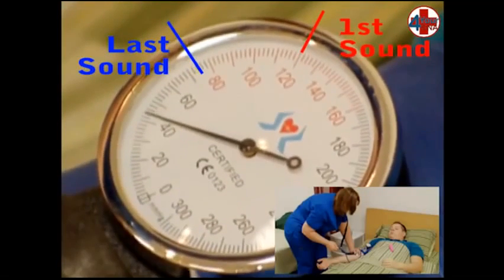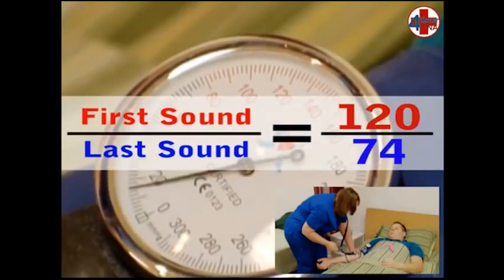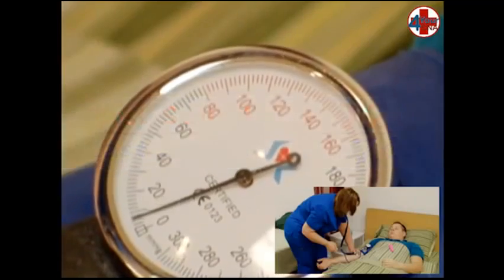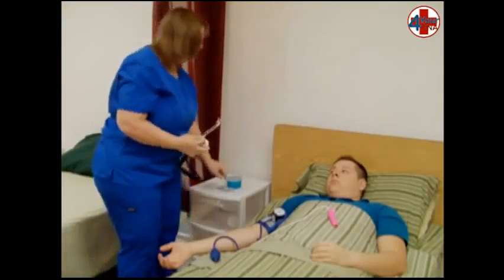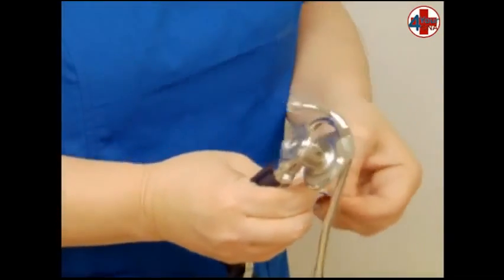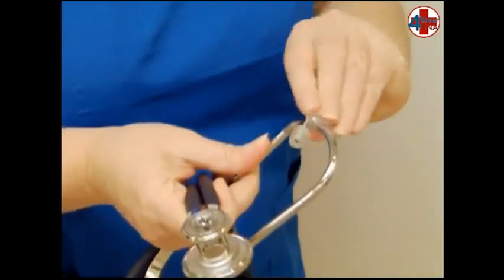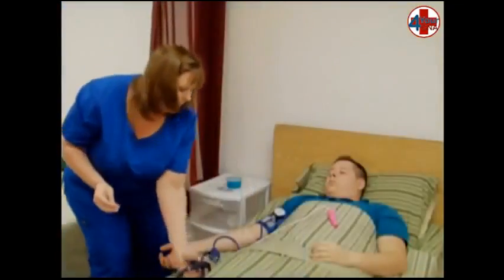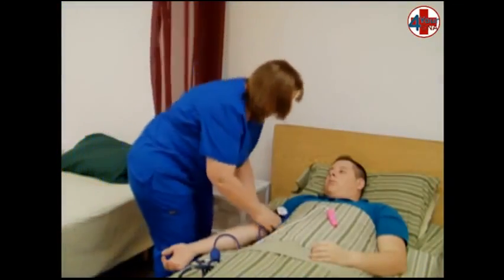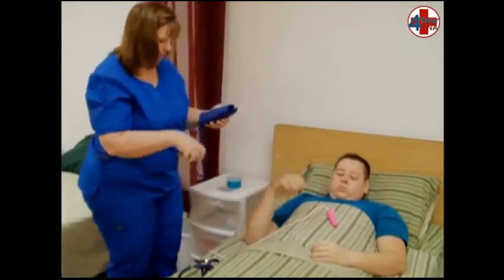Keep this slow controlled rate all the way to zero. In this demonstration, the first Korotkoff sound was heard at 120 and the last at 74. When the needle reaches zero, remove the ear pieces from your ears, open an alcohol swab, and wipe off each ear piece and the larger diaphragm, then throw the alcohol pad away. You will need to clean the evaluator's ear pieces as well. Remove the cuff from the patient's arm and roll for storage, making sure the cuff is completely deflated.